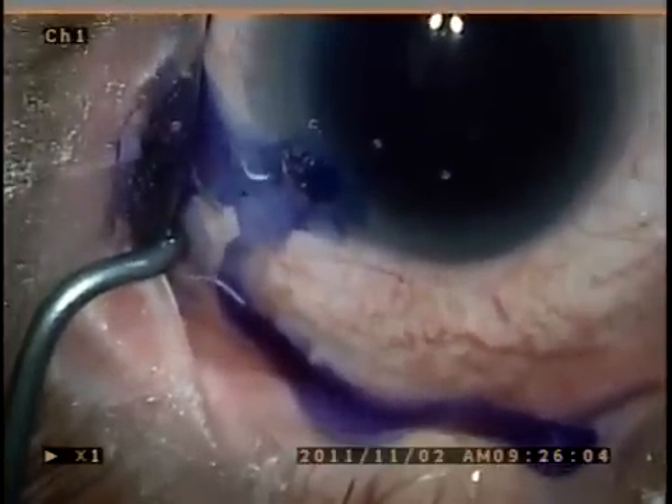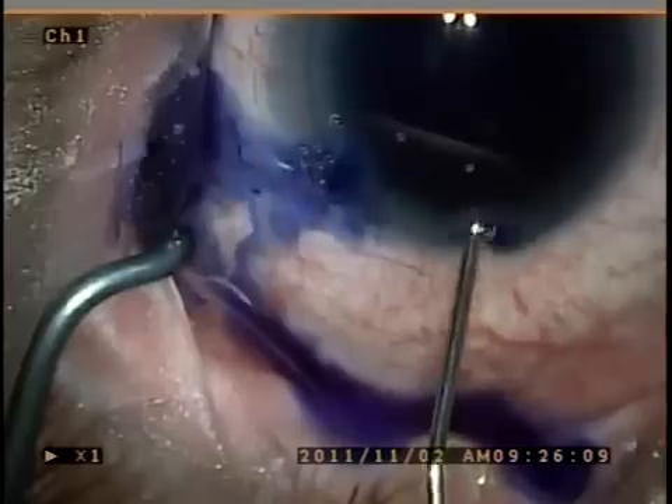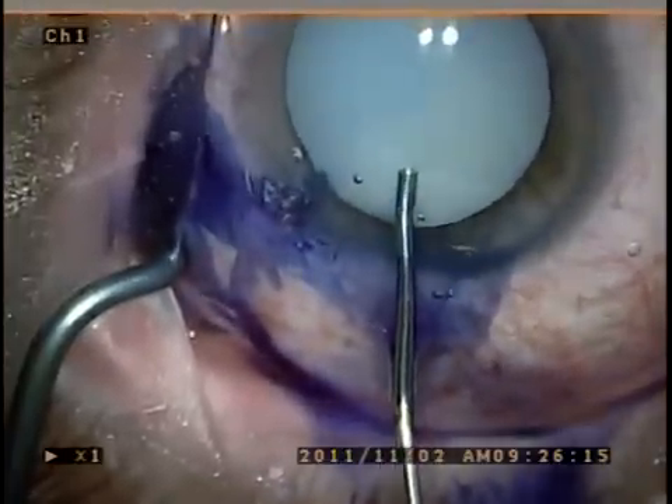Here you can see we're using Trypan Blue in order to stain the capsule and aid in visualization, after which it is evacuated with viscoelastic.